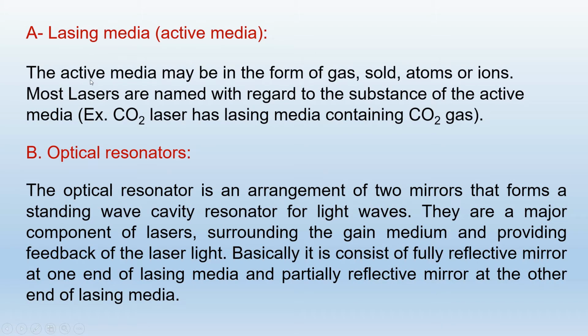The lasing media may be in the form of gas, solid, atoms, or ions. Lasers are usually named according to the substance of the active media; for example, a CO2 laser has a lasing media containing CO2 gas.